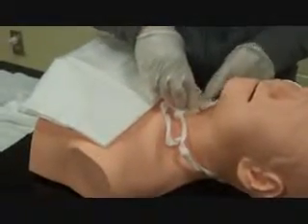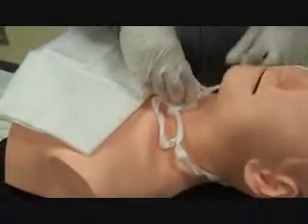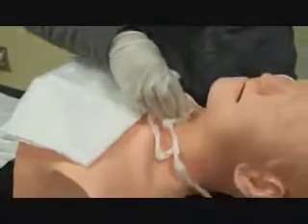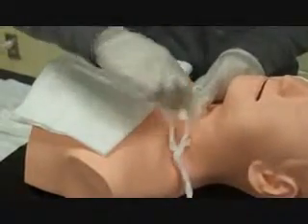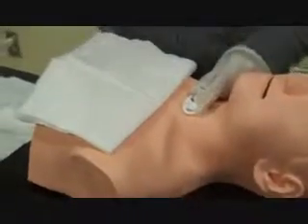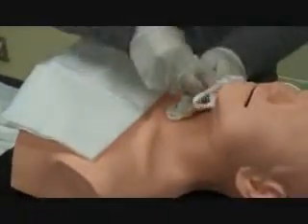So now we have cleaned the inner cannula and cleaned the stoma area, and now we need to remove the cloth ties. So when doing this, you will first remove the dirty cloth ties. And remember to stabilize the tracheostomy tube by holding it. Discard this, and you will now replace it with a new one.